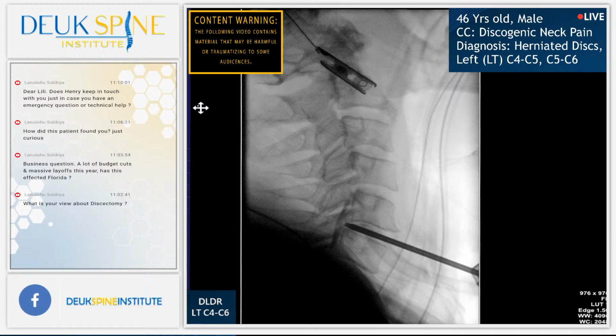Okay, 2, 3, 4, 5, 6. We're at 5, 6. Everyone agree? We're going to come out of 5, 6. We're going to go up to 4, 5. The next disc, C4-5. By the way, you see we've lost literally 1 drop of blood so far. We may lose a couple of drops here, but this is a bloodless surgery. There's no bleeding.